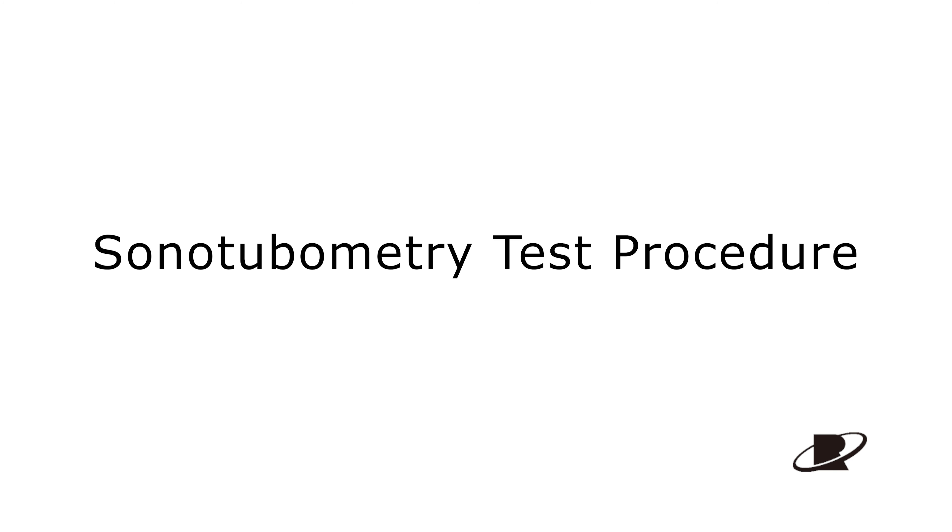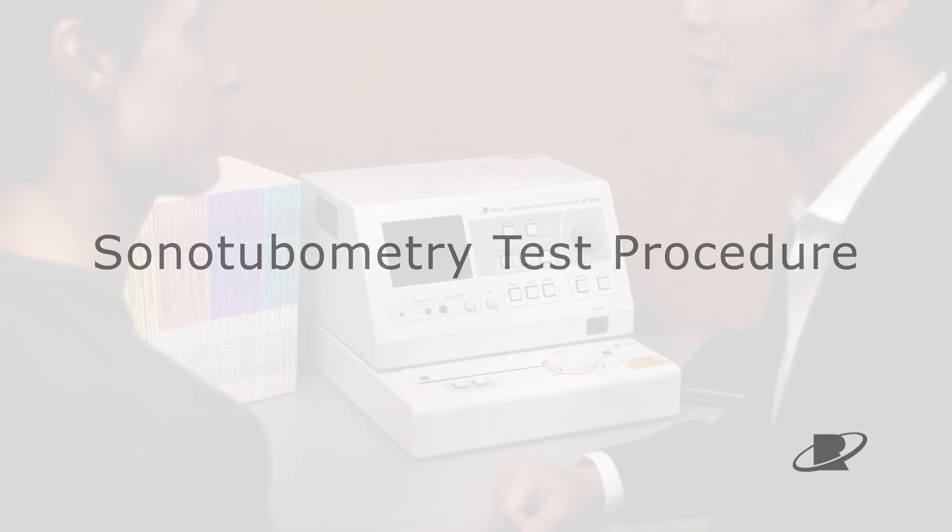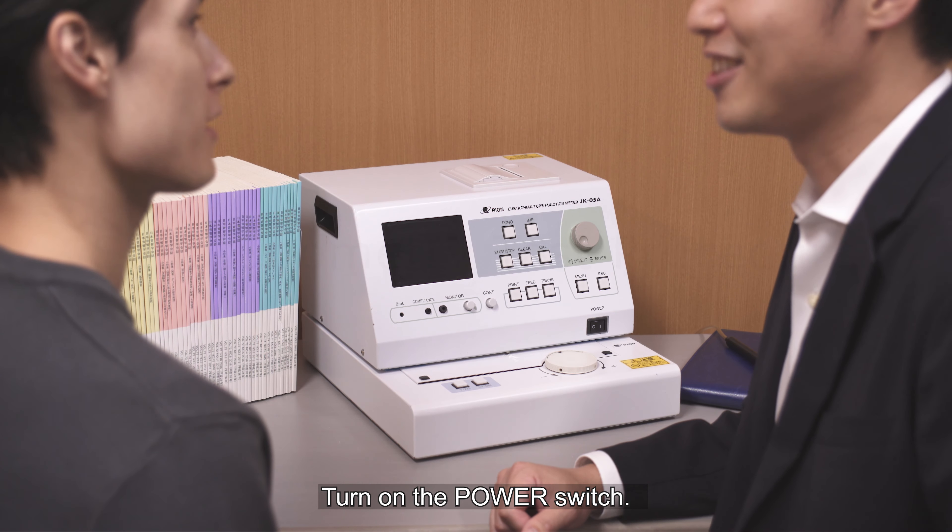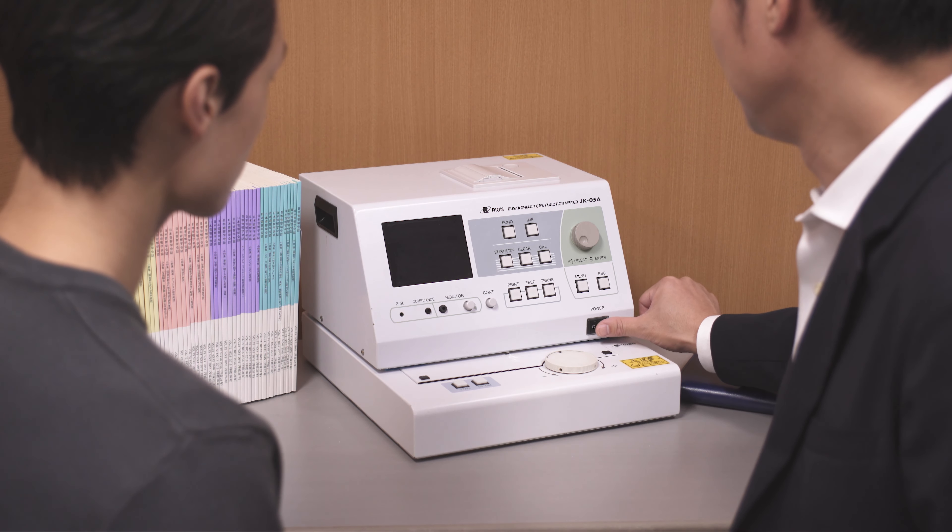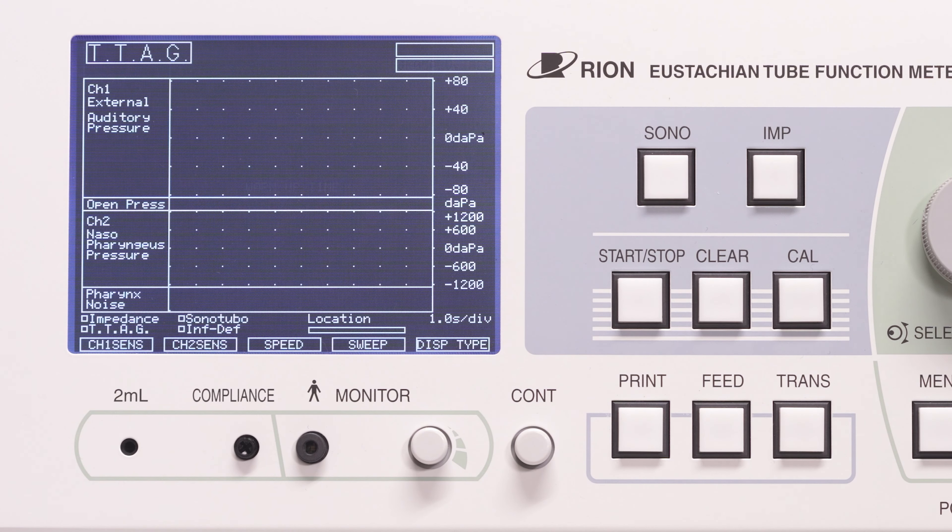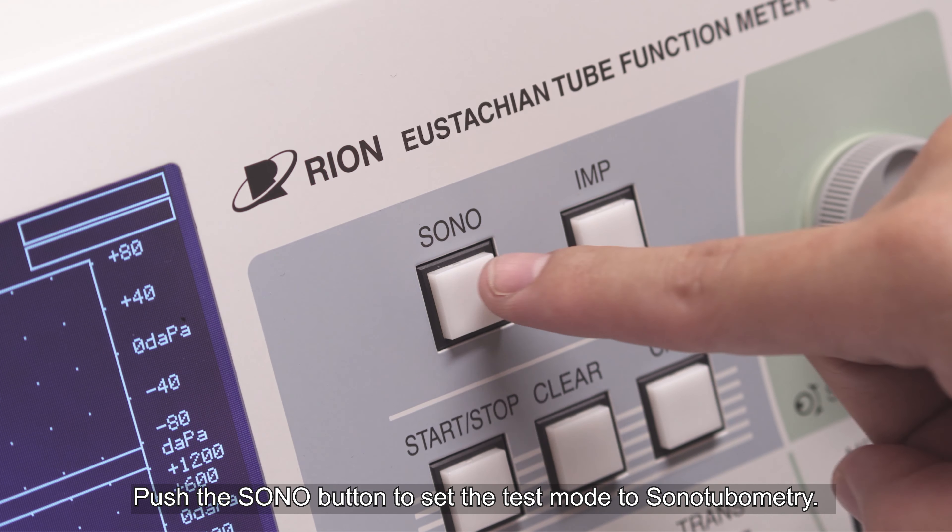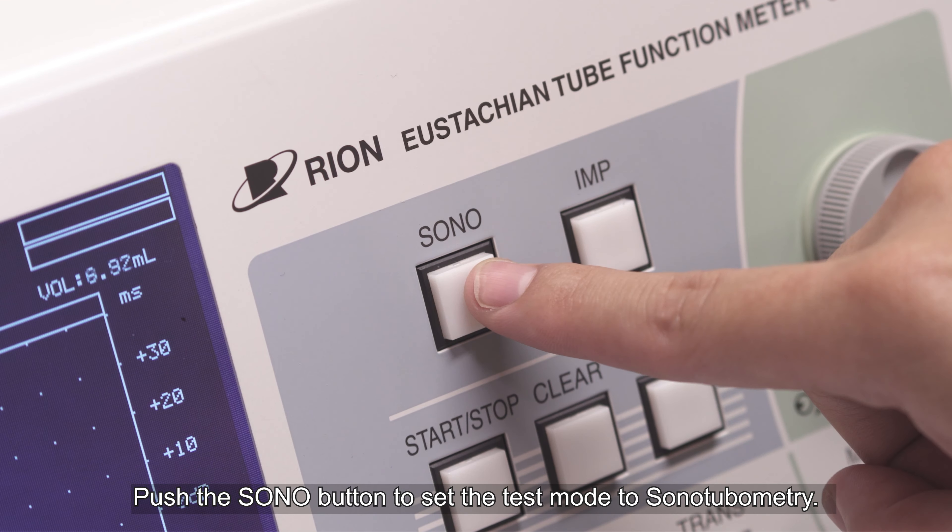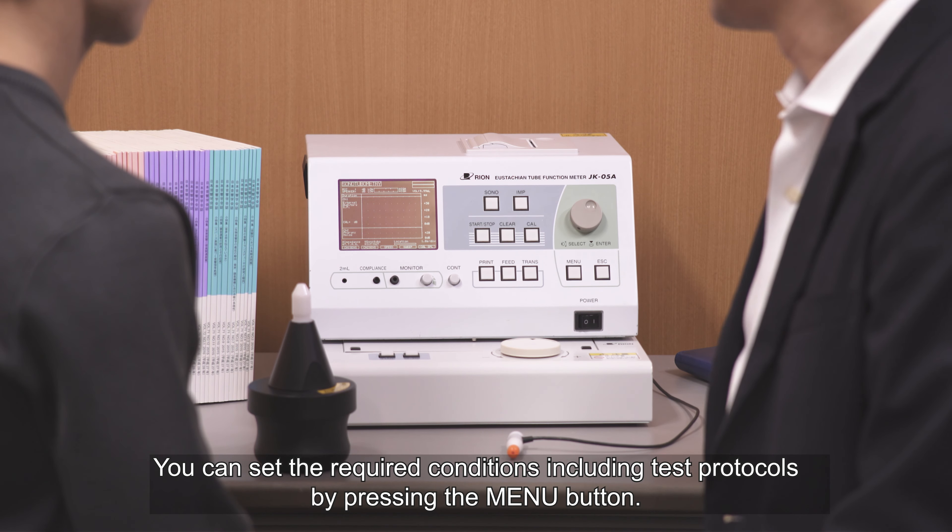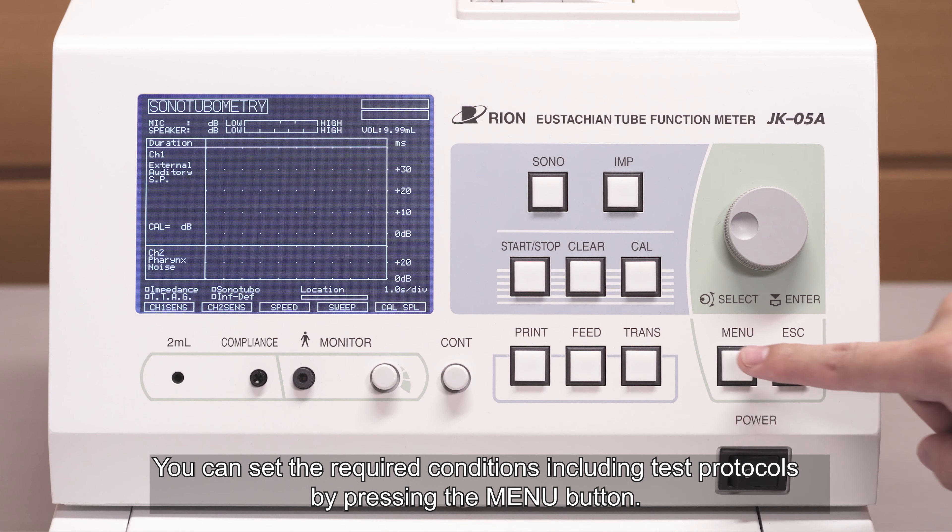This section will demonstrate the full test procedure. Turn on the power switch. Push the SONO button to set the test mode to sonotubometry. You can set the required conditions, including test protocols, by pressing the MENU button.